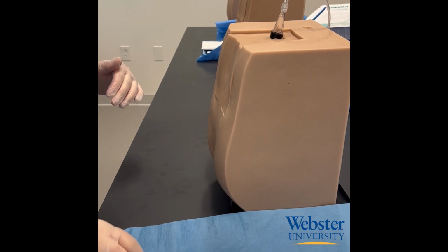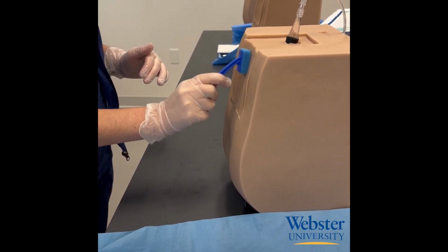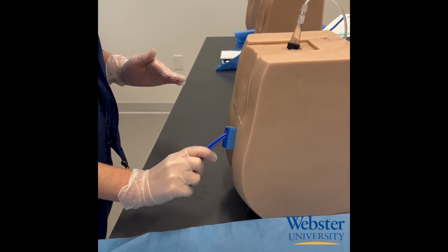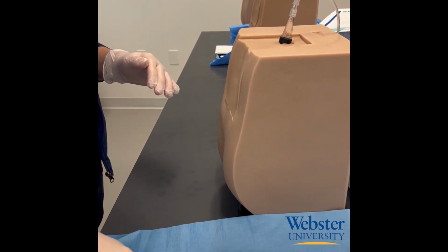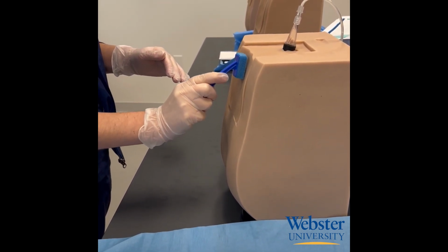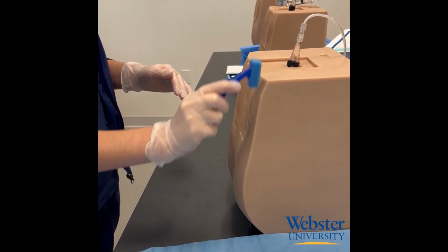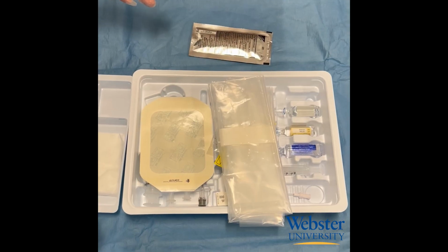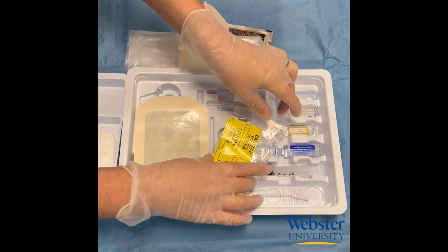The betadine needs to be completely dry to clean the skin effectively, and this takes about 2 to 3 minutes. So at the end, while this is drying, then I can set up the rest of my tray. To set up the tray, first make sure everything is open, out of its packaging, and easy to grab.